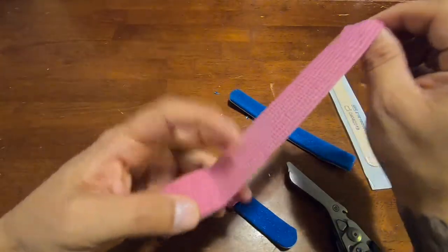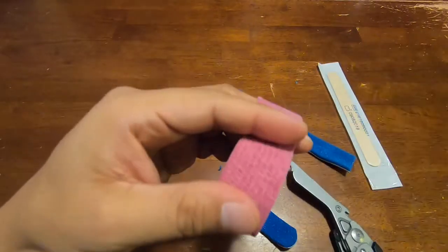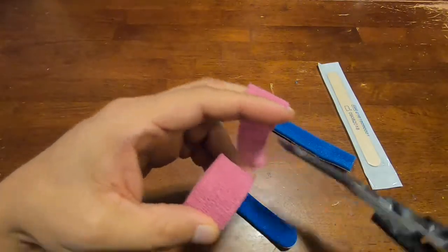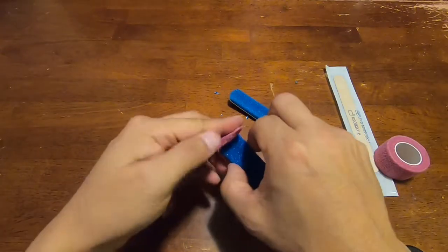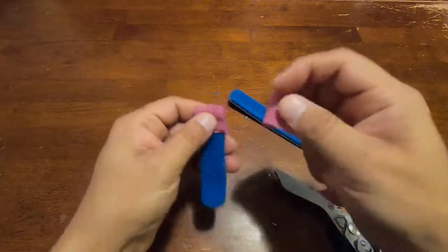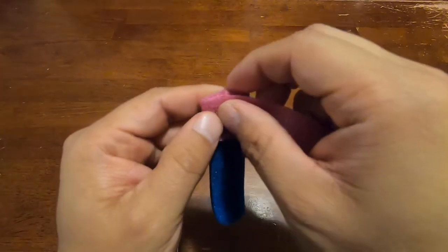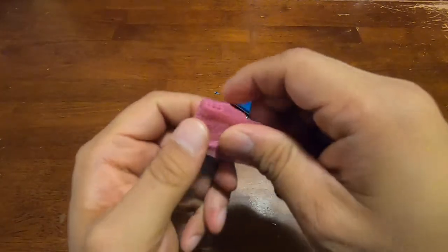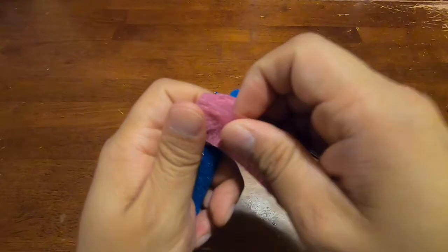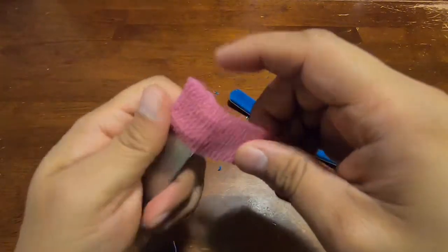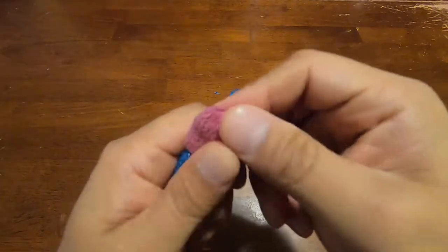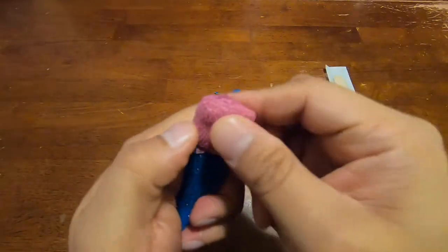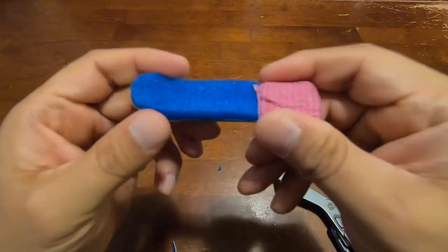And then just cut me off a longer piece, and then from there I'll wrap it around the other way, basically just securing this over the end that's been cut. So you see there's no jagged, not open end, and so there you go, so you're protected from causing any more injury to yourself.